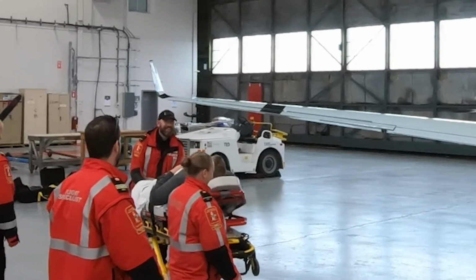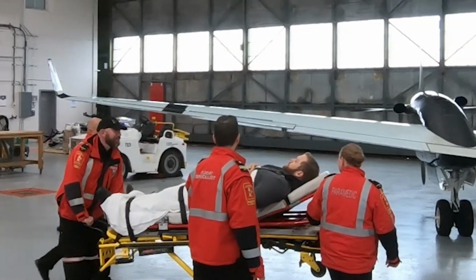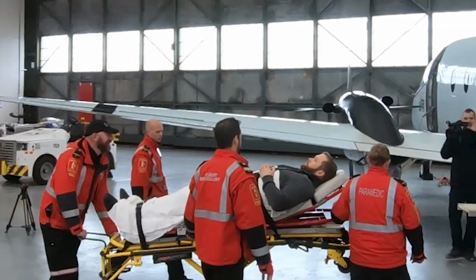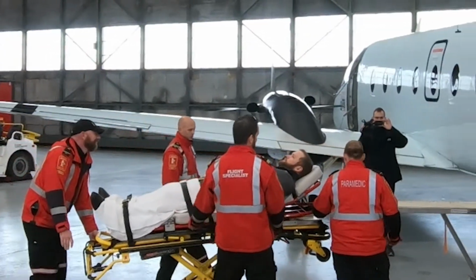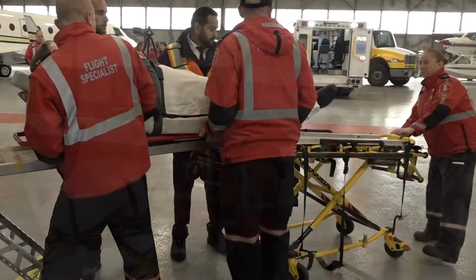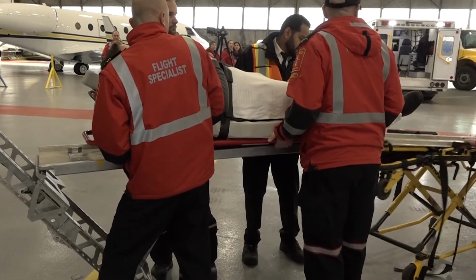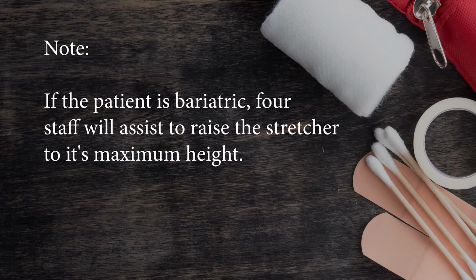5. The 2 ground paramedics will push the stretcher to the aircraft, will raise the stretcher to its maximum height, and will position same such that the patient's head is towards the end of the lift platform. Brakes will not be applied as the stretcher will be moved quickly for the 5th person to assist with the transfer. Note: if the patient is bariatric, 4 staff will assist to raise the stretcher to its maximum height.